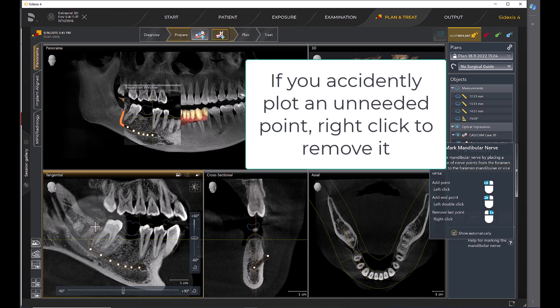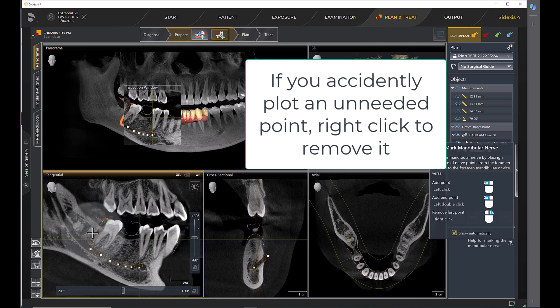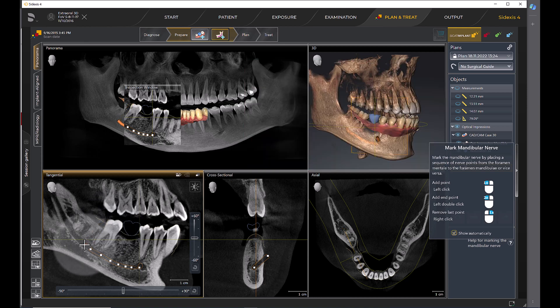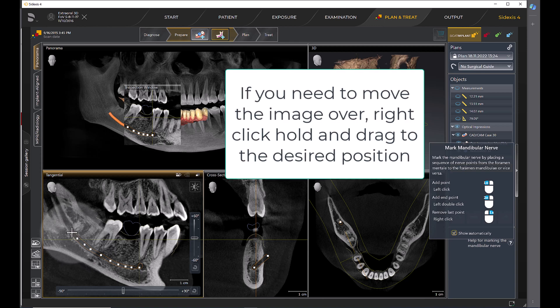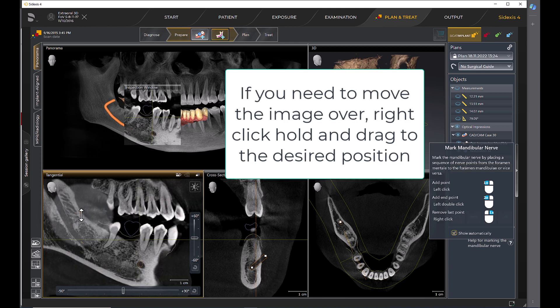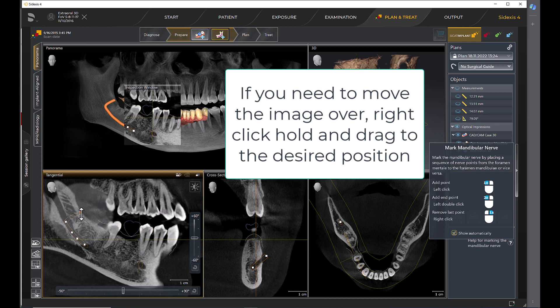If you accidentally plot an unneeded point, right-click to remove it. If you need to move the image over, right-click hold and drag to the desired position.